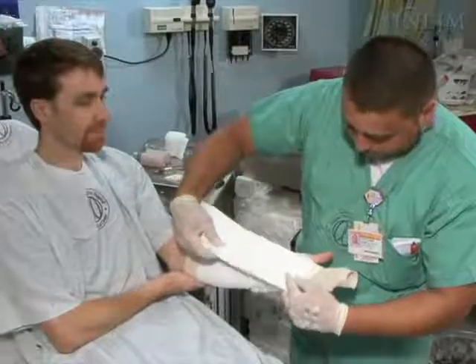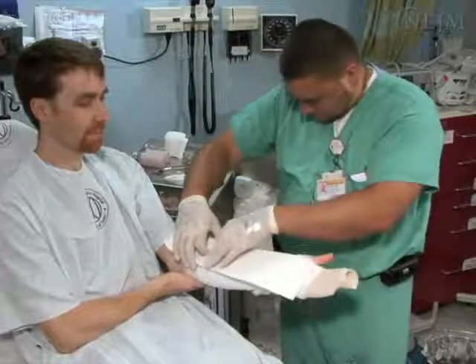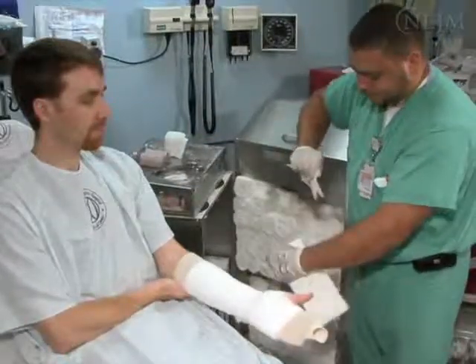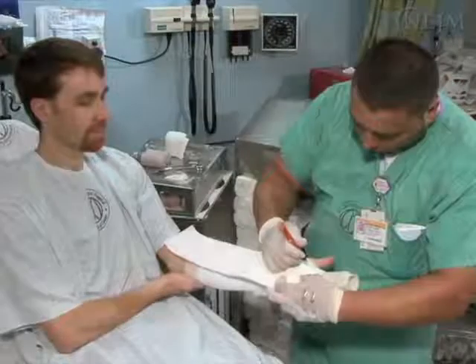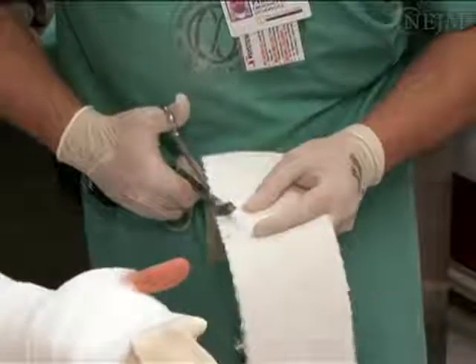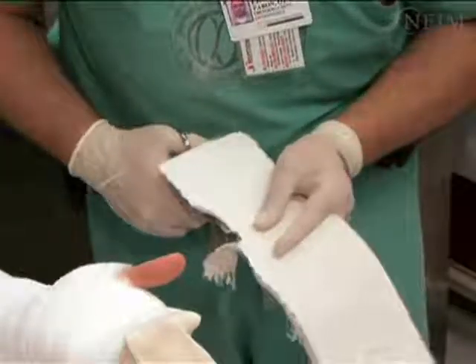Select a piece of dry plaster that is slightly wider than the limb to be immobilized. Measure the length of the splint material required and then cut or tear the dry plaster material to the appropriate length. Use at least 8 layers of plaster material for upper extremity splints and 12 layers for lower extremity splints to provide adequate strength to the completed splint.